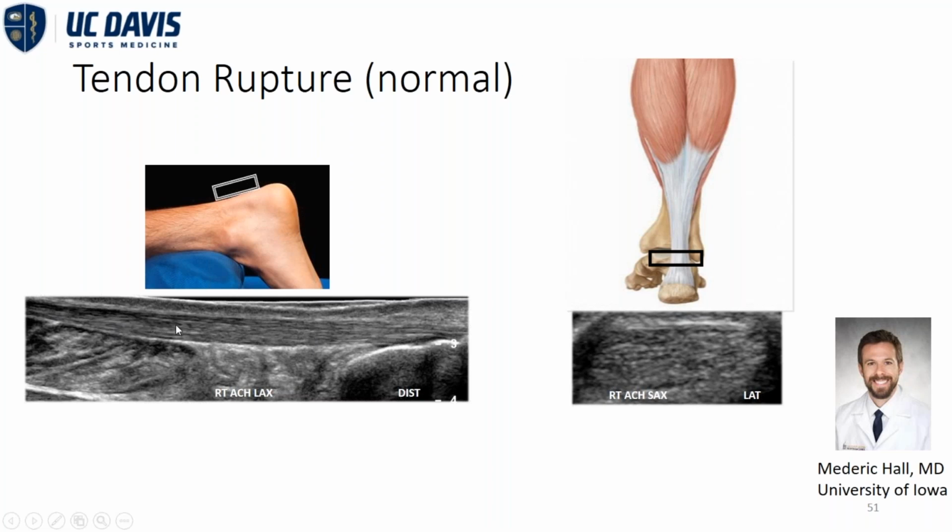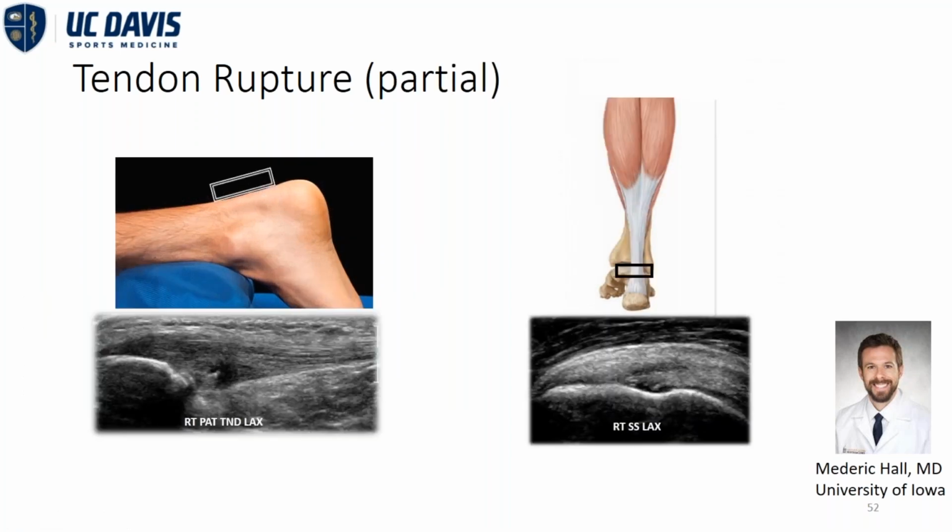This is just fantastic. Some people describe this as finely combed hair or fine copper wire. So you just get a nice look at the echotexture of normal, healthy Achilles tendon coming into calcaneus here. Now, as we move into the short axis and move our transducer 90 degrees, what you see here is Achilles tendon. And you see these beautiful little stipulations. Almost looks like you're looking at a paintbrush head on and you're seeing all the little bristles. So this is normal, healthy tendon appearance.